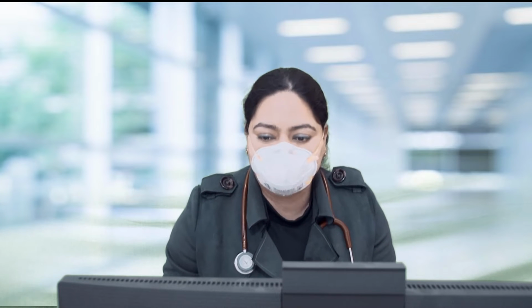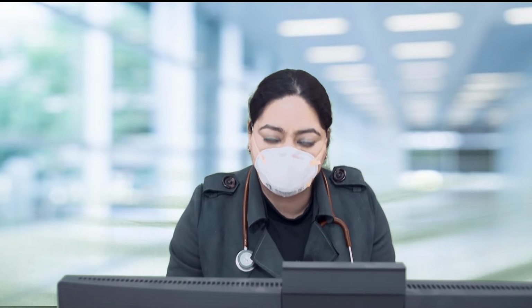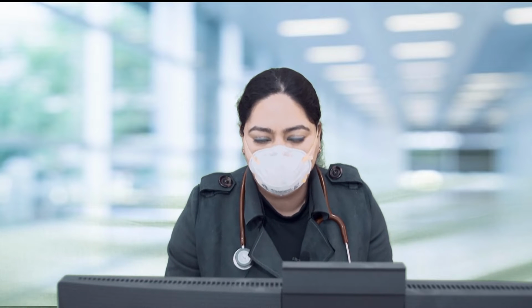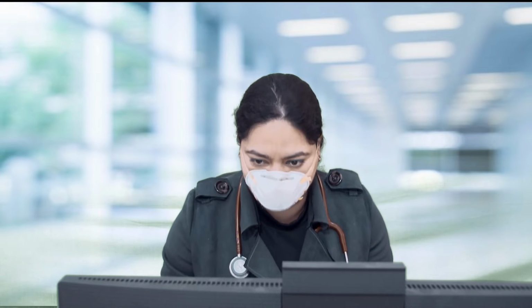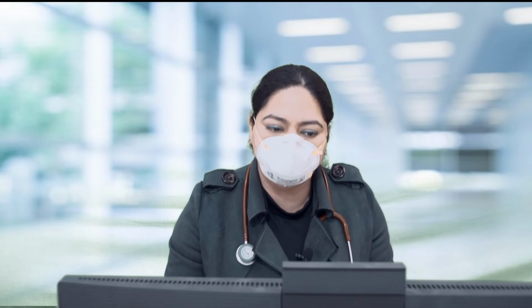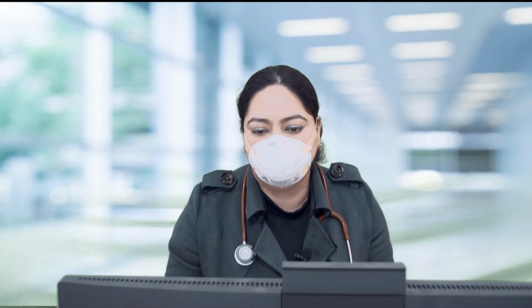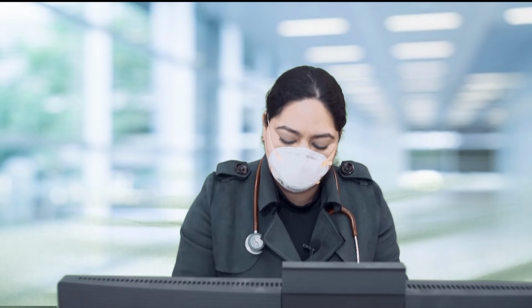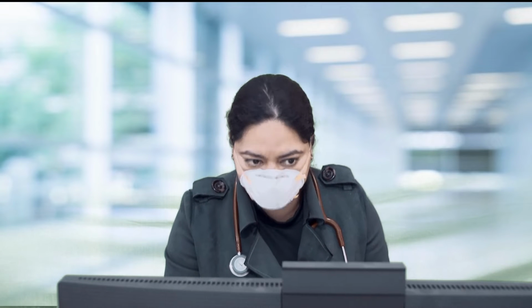In one pilot study, they used BIPAP in patients who had early ARDS, defined as a PF ratio between 200 to 300, and they showed that there was avoidance of intubation in these patients by the use of BIPAP, and it reduced the cytokine levels as a favorable outcome. Hence, we've been using BIPAP in our COVID-19 patients also.